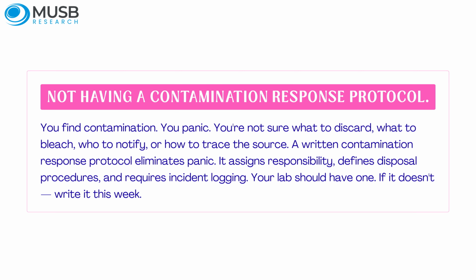4. Not having a contamination response protocol. You find contamination, you panic, you're not sure what to discard, what to bleach, who to notify, or how to trace the source. A written contamination response protocol eliminates panic. It assigns responsibility, defines disposal procedures, and requires incident logging. Your lab should have one. If it doesn't, write it this week.